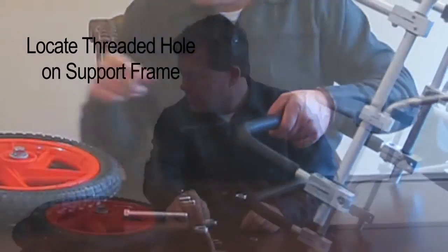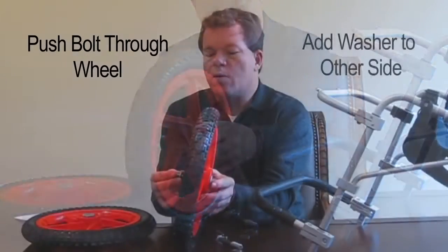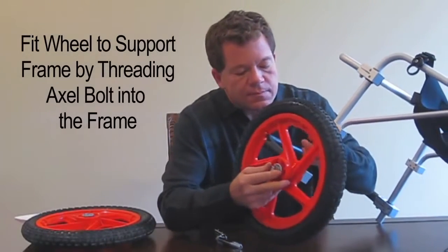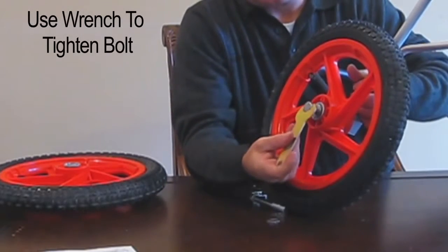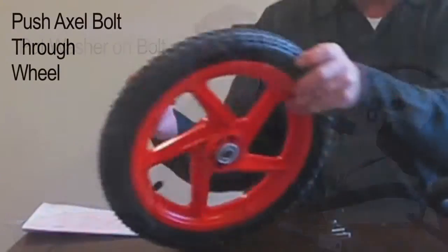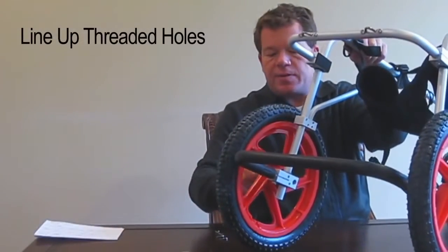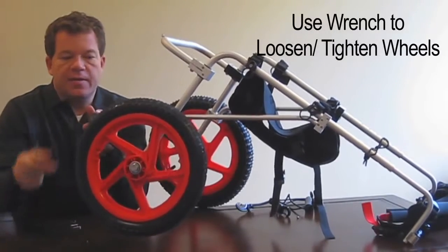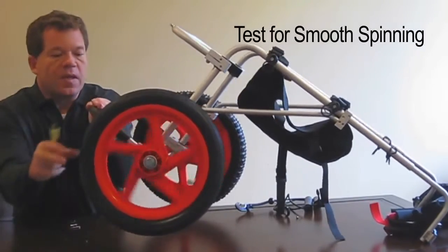Notice this part is threaded — that's where the axle bolt is going to go. Put a washer on the axle bolt, put it through the wheel, then put a washer on the other side, and simply thread it into the threaded section all the way down. Get it finger-tight, then use your supplied wrench to tighten it all the way down. Repeat that for the other side — washer on, thread through the wheel, washer on the other side, line it up with the threads, and tighten down. Once the tire is assembled, give it a spin. If it's spinning slowly, simply back the axle bolt out a little bit to loosen it up and you'll get a free spin.